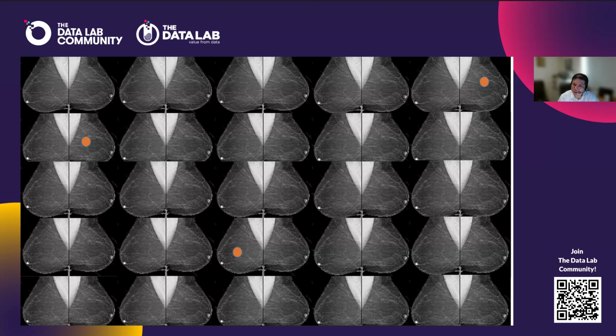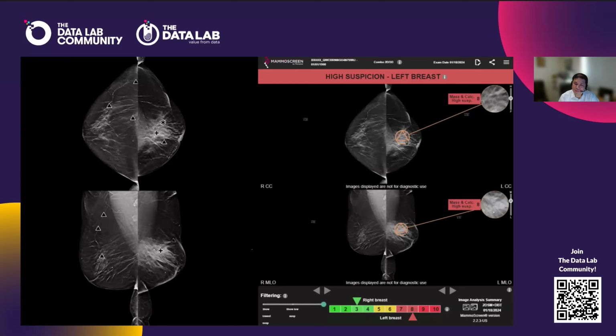I think that's where technology comes in, and that's the hope of AI, and that's been our work for the past many years in the world of breast imaging and AI, where we're trying to find an AI that can say, hey, these areas are suspicious, let's put them in this pile, and the rest of them are normal. So that way it helps with workflow, it helps with cancer detection, and breast radiologists, breast readers, breast radiographers, we are definitely having a sort of recruitment issue, and there's less and less of us coming through.